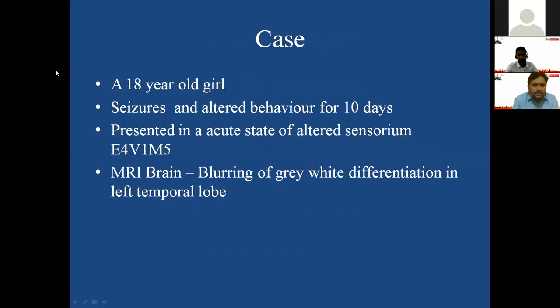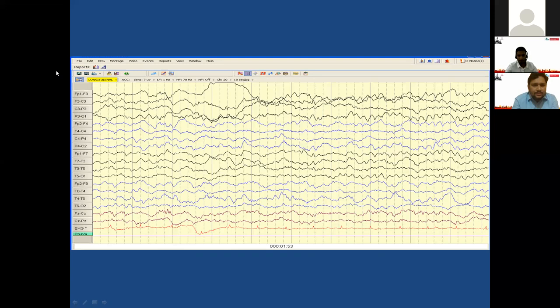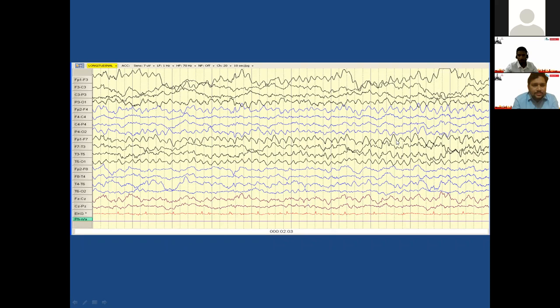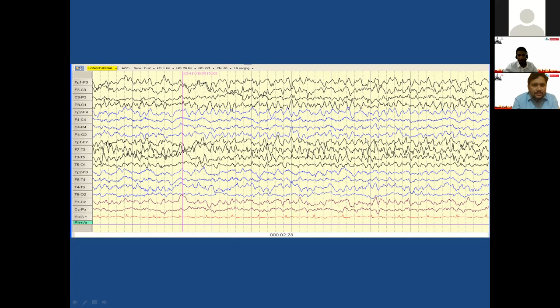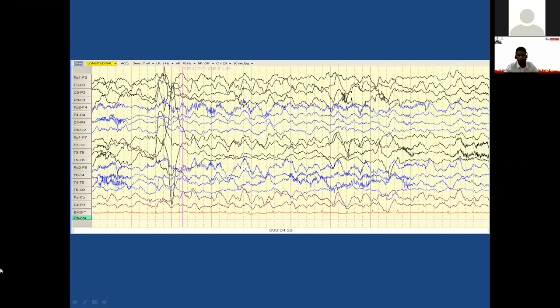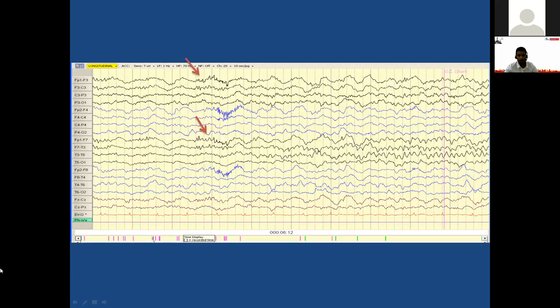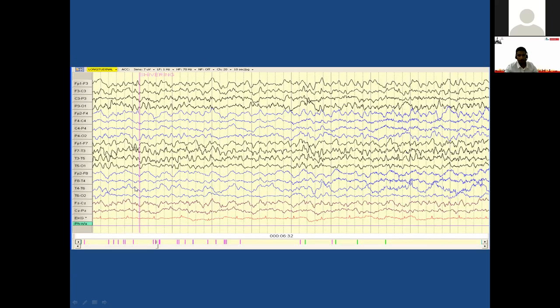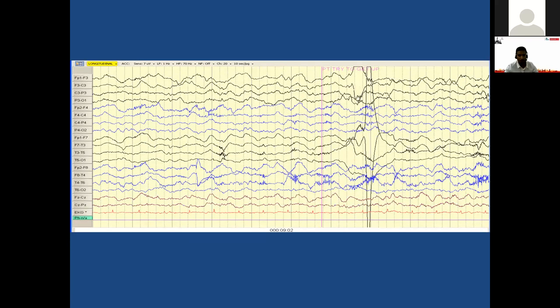Here is a case: an 18-year-old girl with seizures and altered behavior for 10 days, presenting with GCS of 10 and MRI showing blurring of gray-white differentiation in the left temporal region, pointing toward focal encephalitis. The EEG initially shows diffuse slowing, then rhythmic activity building up in the left temporal region, becoming clearer as a seizure propagating in the left hemisphere. The EEG technician noted the patient was non-responsive during the event; afterward the patient tried to get up. Spikes are clearly seen in the left frontal-temporal region — a typical example of focal encephalitis, most commonly herpes encephalitis.